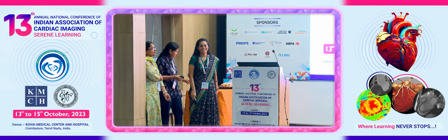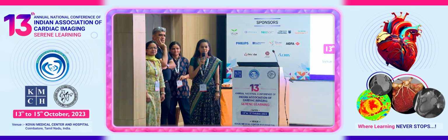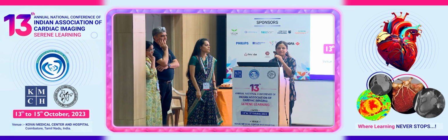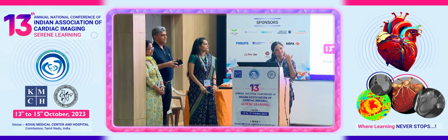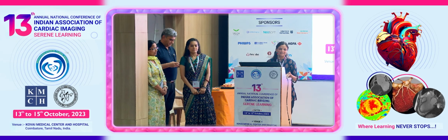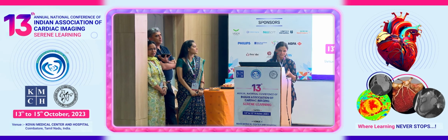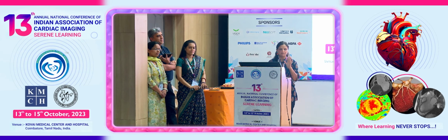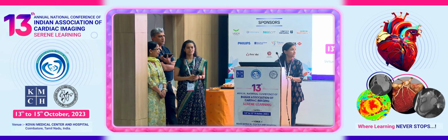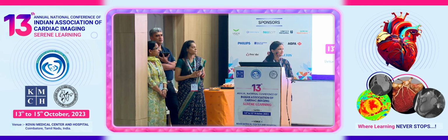Why do you do 2 non-gated? We don't do 2 non-gated, ma'am. We do 1 gated, 1 non-gated. No, why do you do 2 non-gated? We find enough diagnostic quality images even in the non-gated first scan. Even the proximal coronary arteries are nicely seen. Rather than going for gated, increasing the scan time and the radiation we are giving, we have found this useful. Do you have a dual source scanner or single source? One single source, 128 slice.